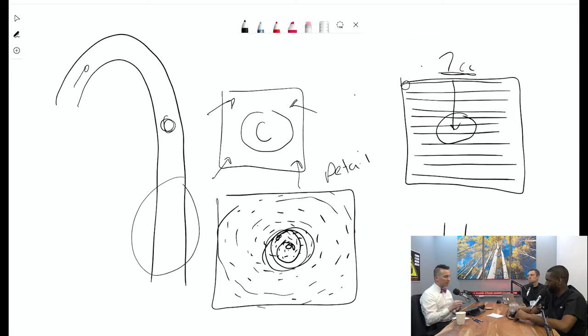And that's the thing about the renals. That's the thing about anything in the abdomen: the amount of information that you can gather inside of that 3D k-space is going to be contingent on how long that patient can actually hold their breath. Right. But for the carotid, I don't breath hold for carotids.